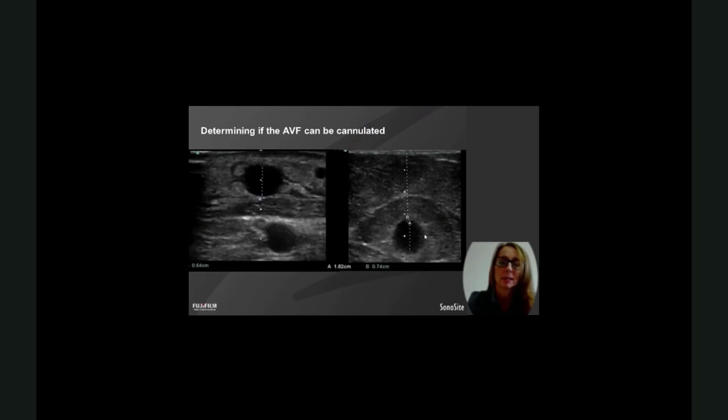I get a little bit of blood bleeding up into my needle and I get those clots that we talk about where we think that the vessel's clotted, but actually we've just cut a hole in the side, put a little bit of blood in and it's clotted the needle. So having an ultrasound to keep my needle tip on track the whole way down, keep my angle right, I'll be able to get into those deeper ones.